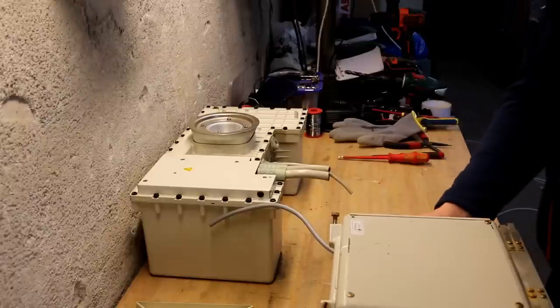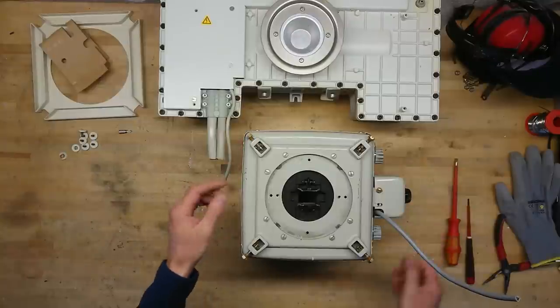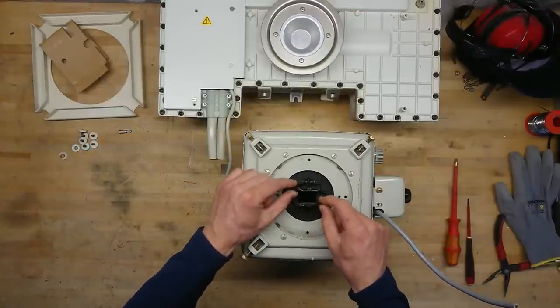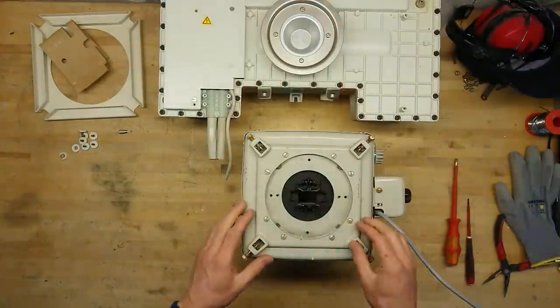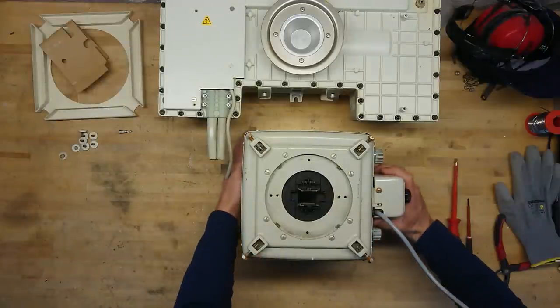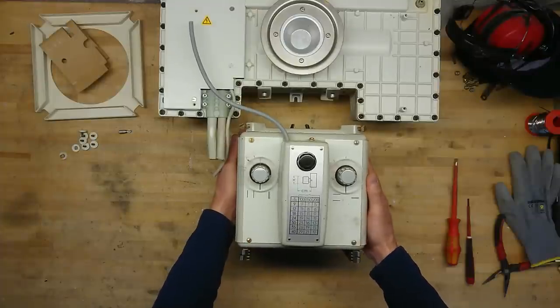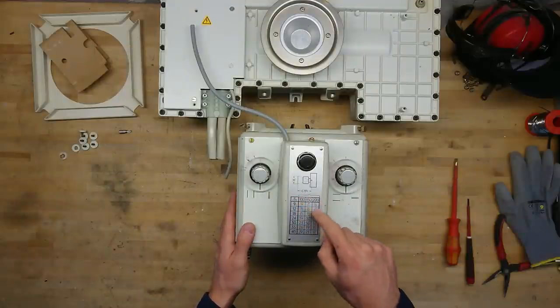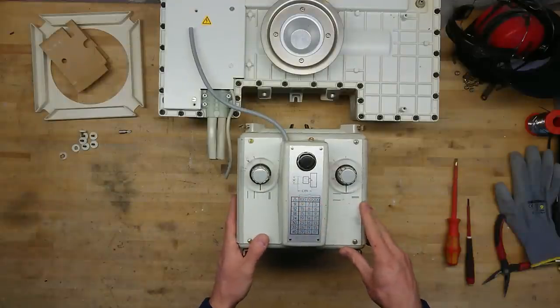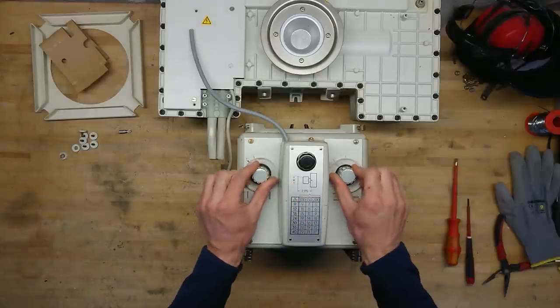Take a look at the collimator. It's actually a quite narrow port that it has here to guide the X-rays inside, with these dials at the side. Depending on whether you're 1 meter, 1.5 or 2 meters from the person, you have to adjust the window according to these dials here.